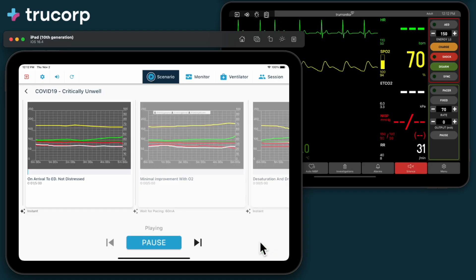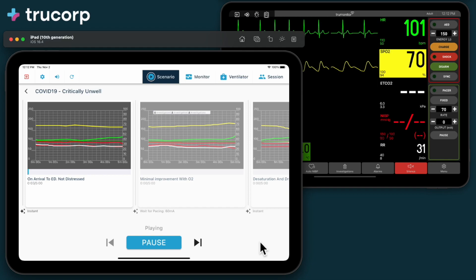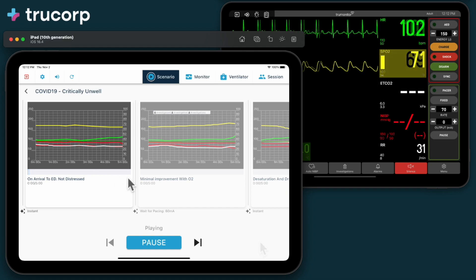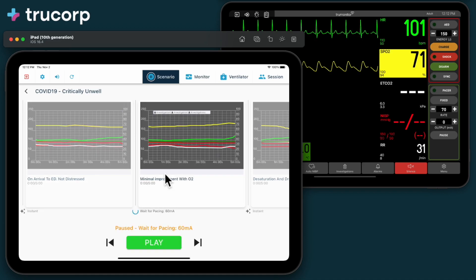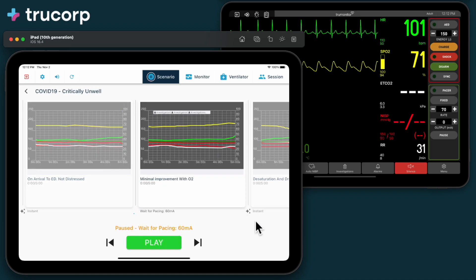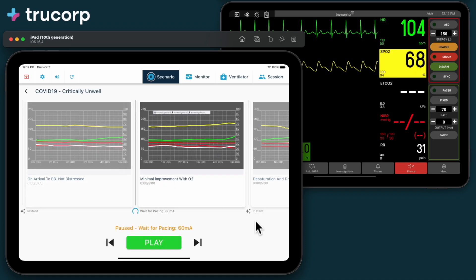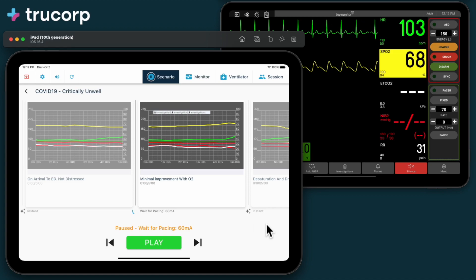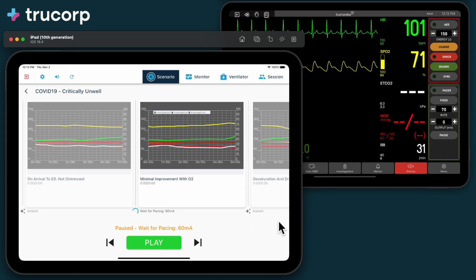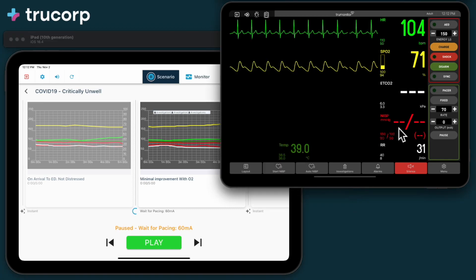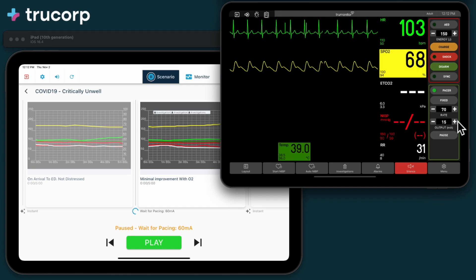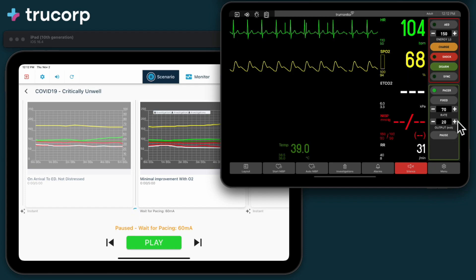The first step begins, and the values start to automatically update on the student monitor. The instructor can manually skip ahead by double-tapping any step. Here, our scenario trigger specifies that pacing above 60mA should be achieved before that step begins playing. Our student initiates pacing, and when 60mA is achieved, the scenario automatically continues.